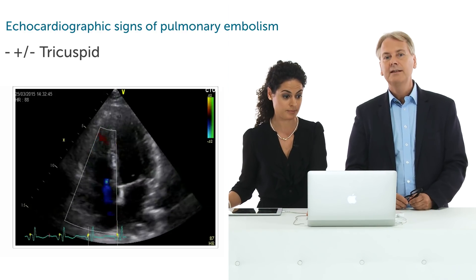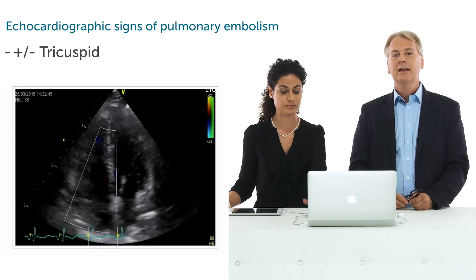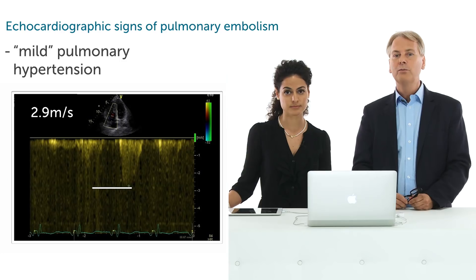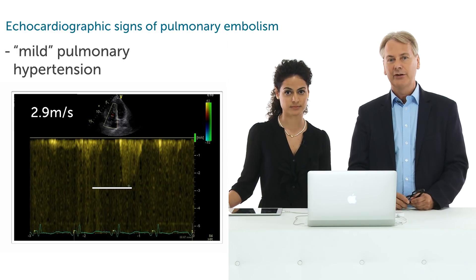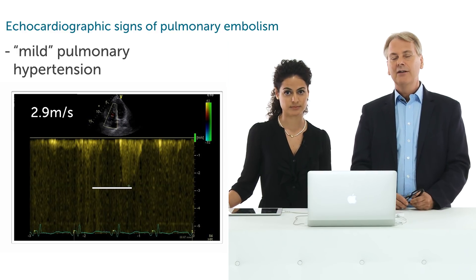So don't be deceived — you cannot exclude pulmonary embolism if you do not have tricuspid regurgitation. And if you look at the velocity across the signal, you see it's only 2.9 meters per second.